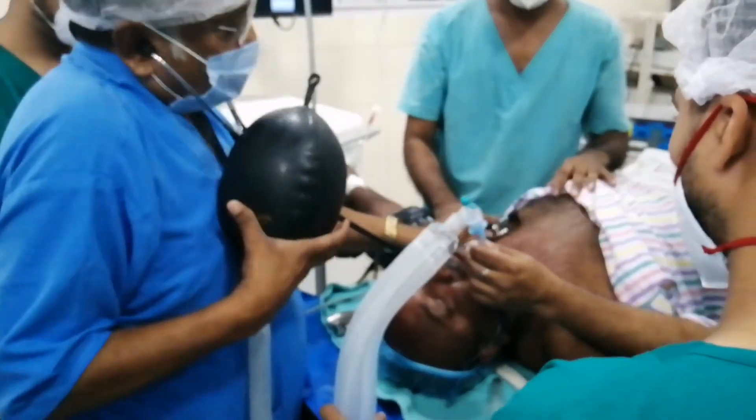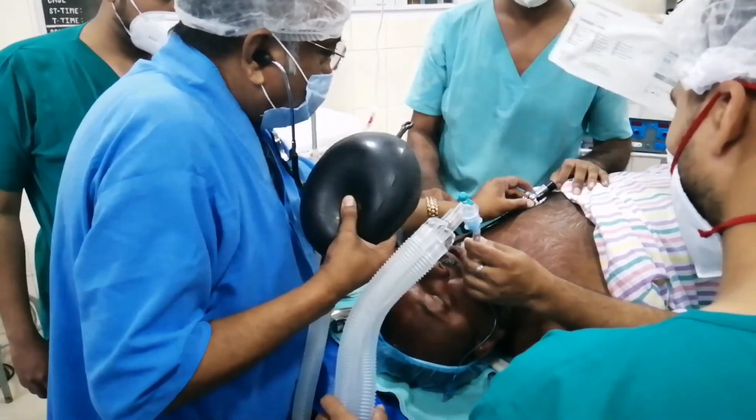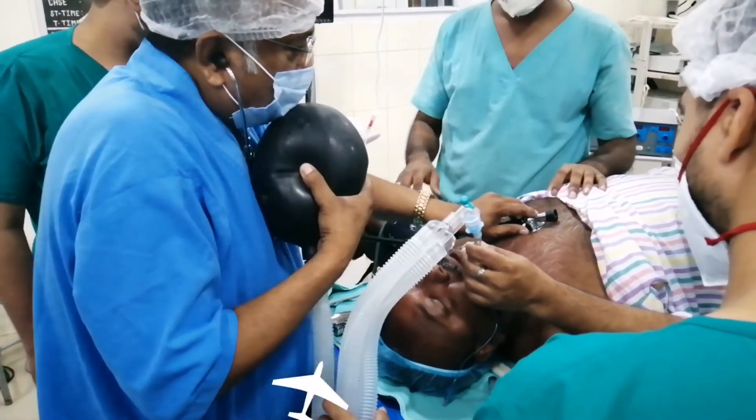Many times the tube may be malpositioned and that may cause problems for the patient. This is how the patient is completely put to sleep and kept under general anesthesia while we perform the surgery.